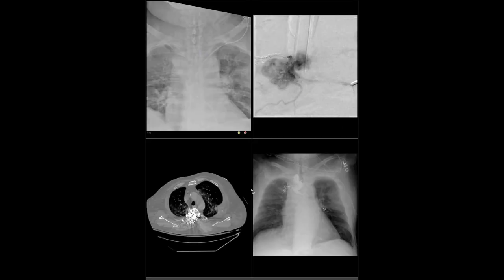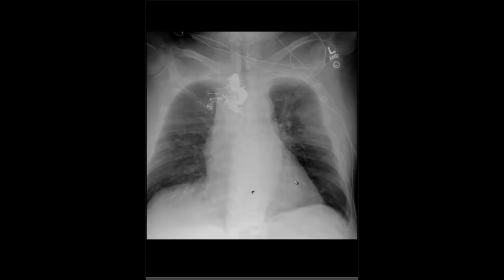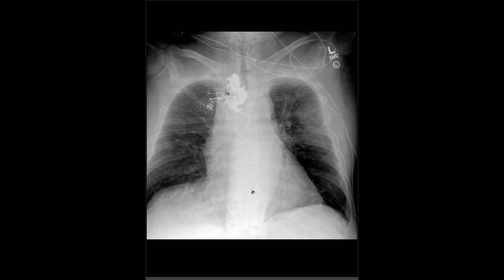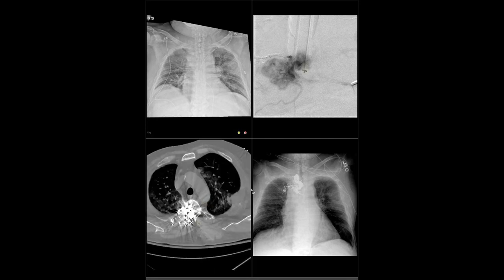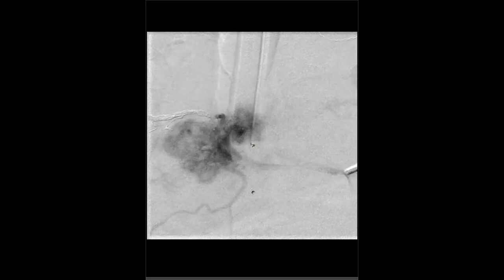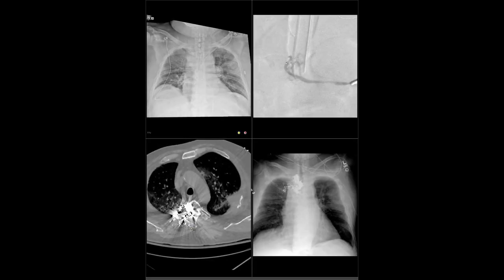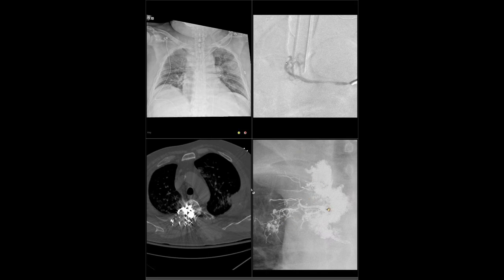This is an interesting radiograph appearance. This is a gentleman with metastatic renal cell carcinoma - this is a preoperative radiograph, and this is the postoperative radiograph. I wasn't sure what this material was - it clearly looks tubular and branching. It turned out he had many spinal metastases, and as part of preoperative preparation prior to resection of one of the metastases, he underwent embolization. You can see the Onyx embolic material present here in a pretty large amount within the vessels.